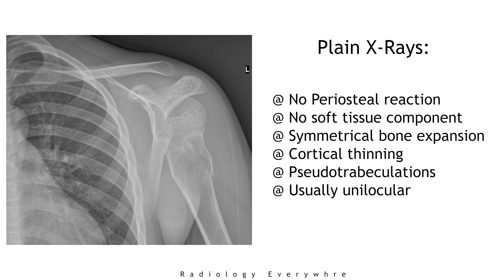Simple bone cysts expand the bone symmetrically and cause thinning of the cortex without any breach unless there is a pathological fracture. You can see prominent ridges of bone that appear as pseudotrabeculation on x-ray, but these are usually unilocular. Rarely, they can be truly multiloculated, which usually occurs after repeated fractures.